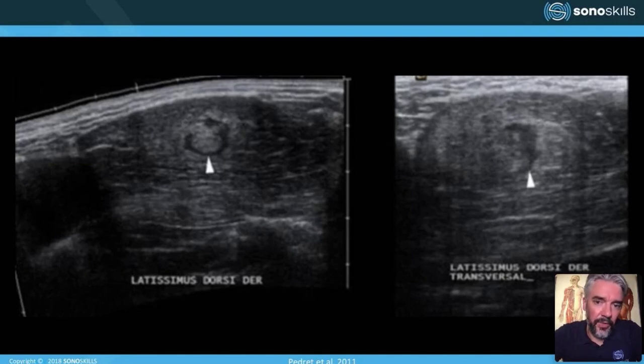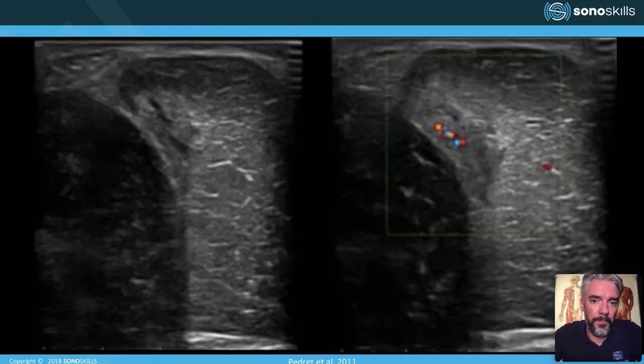And in this case, we can see a latissimus dorsi muscle problem and strain. So if you would follow the latissimus dorsi towards the arm, then you see this not often, but I saw it a few times with some sports people in bodybuilding pressing weights.